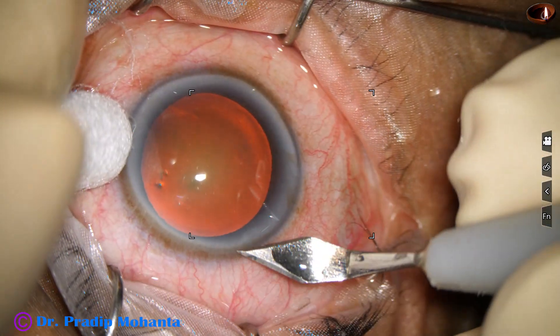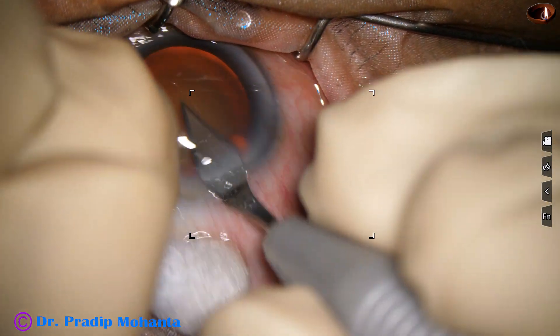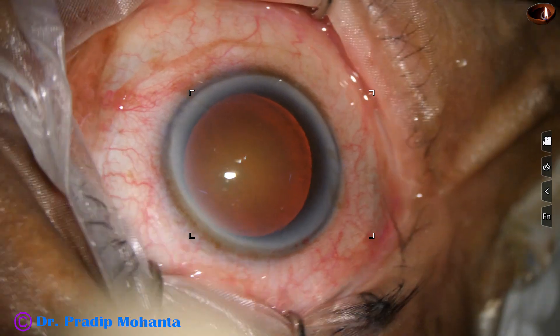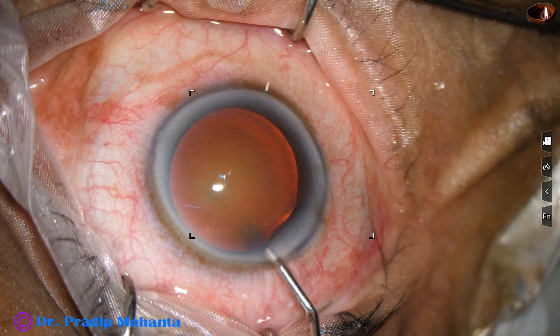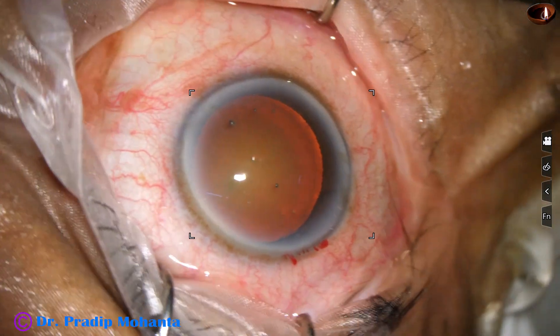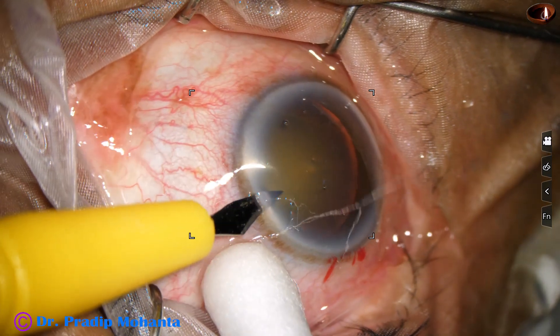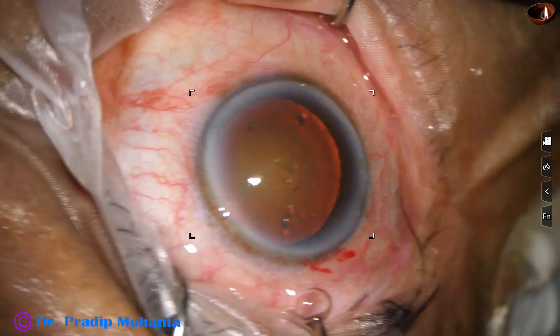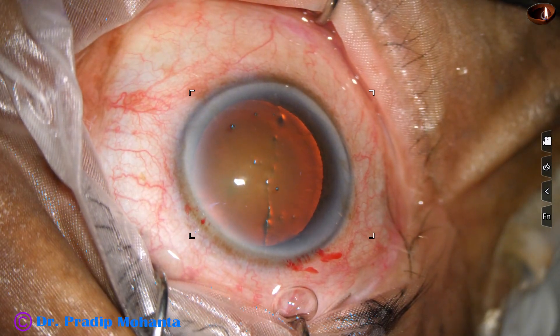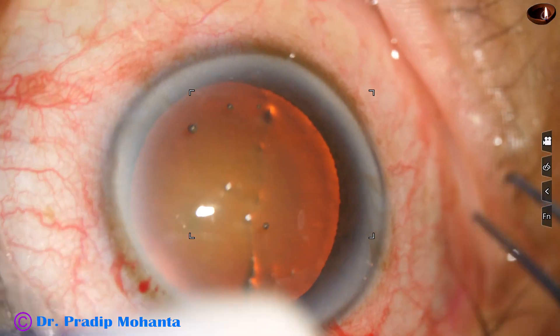This is the main incision with a 2.8 millimeter steel keratome. We can see very nice red glow in this case. The anterior chamber is filled up with 2% hydroxypropyl methyl cellulose, and a side port is made on the left side of the main incision about 2 and a half clock hours away. The microscope is OMS 90 from Topcon.